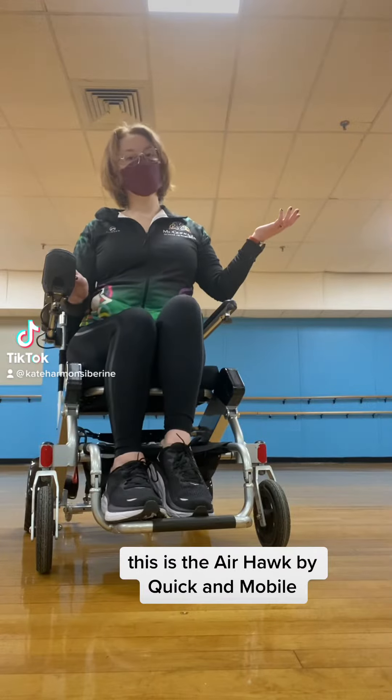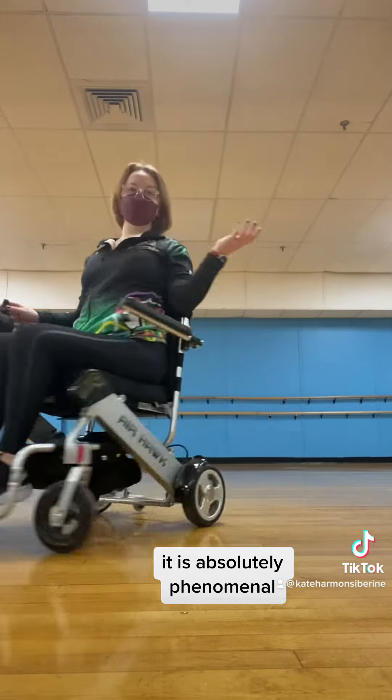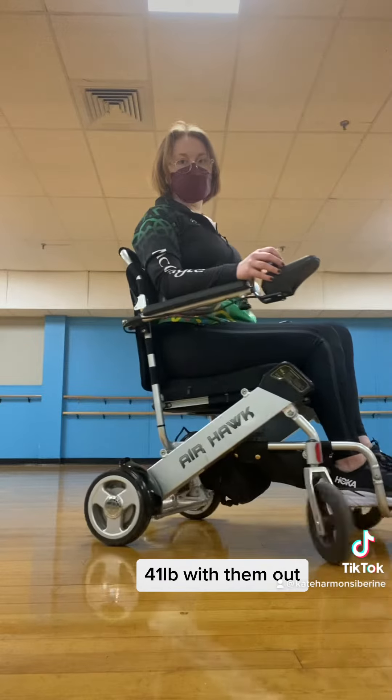It's time for my wheelchair tour. This is the Air Hawk by Quick and Mobile. It is absolutely phenomenal. It weighs 48 pounds with both batteries, and 41 pounds without.